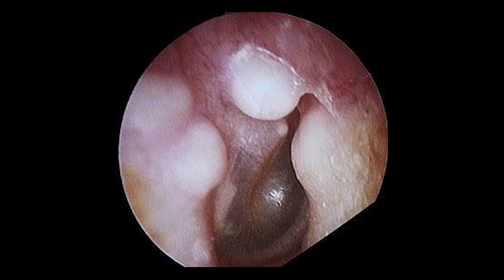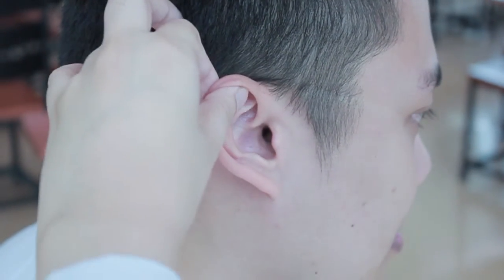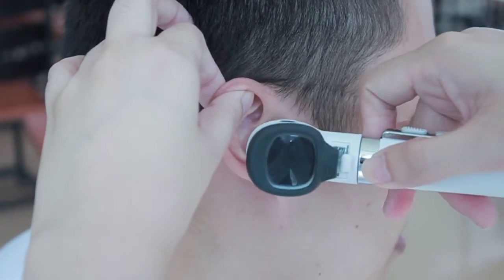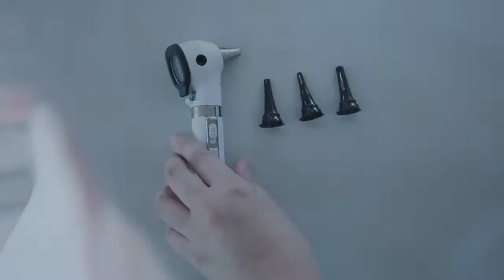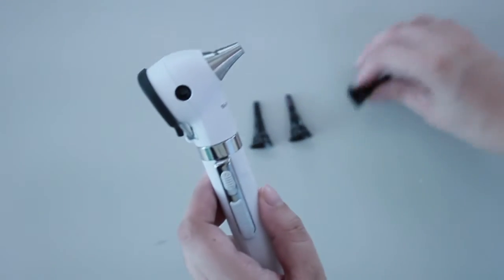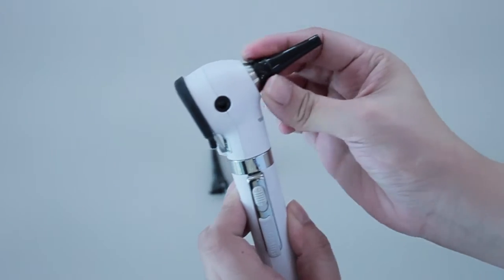In using the otoscope to examine the ear, pull gently posteriorly on the helix, a maneuver that straightens the normally S-shaped canal and allows for better visibility. One should use the largest speculum that the ear canal can accommodate, as this increases visibility.